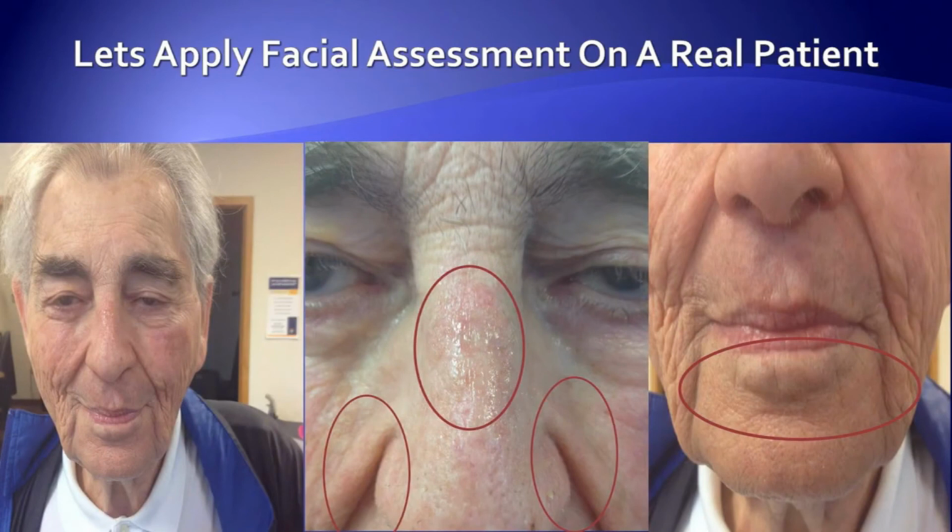As we take a close-up look at the face, we can see that there's a pressure sore right on the bridge of the nose. If we look further, on opposite sides of that pressure sore, it looks like the surface of the nose curls in, which are opportunistic locations for the air to flow into the eyes. Looking a little farther down the nose, we see where the frown lines are.